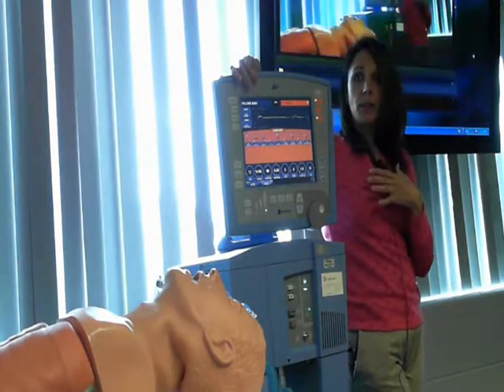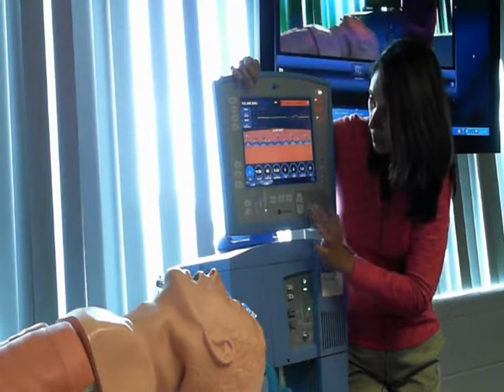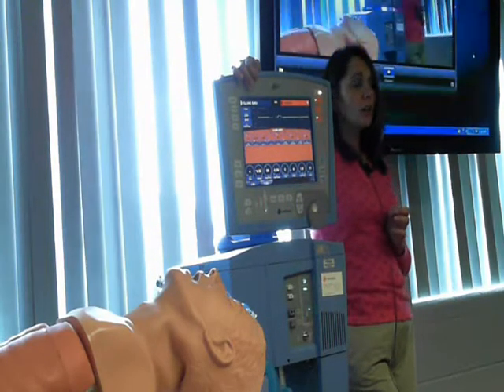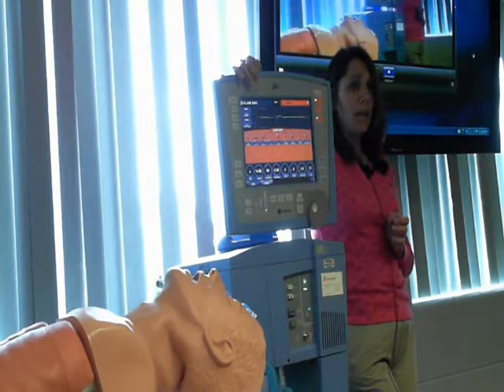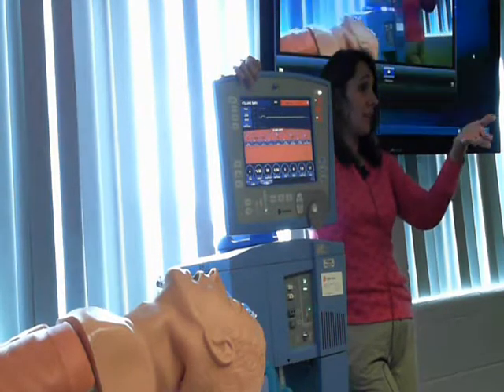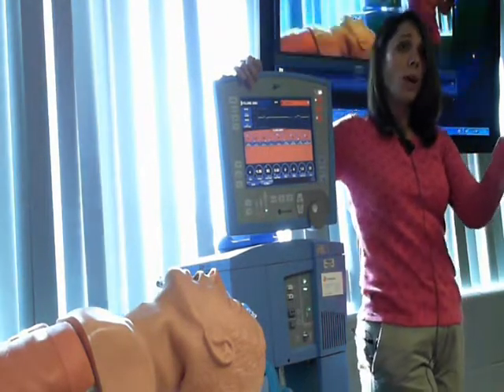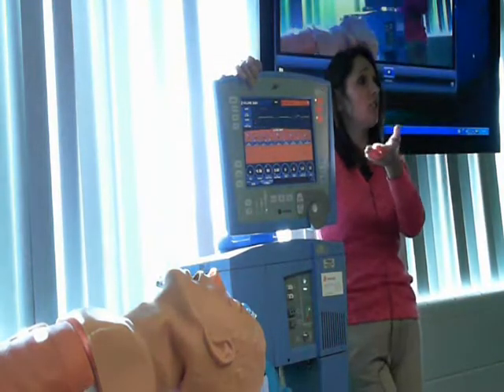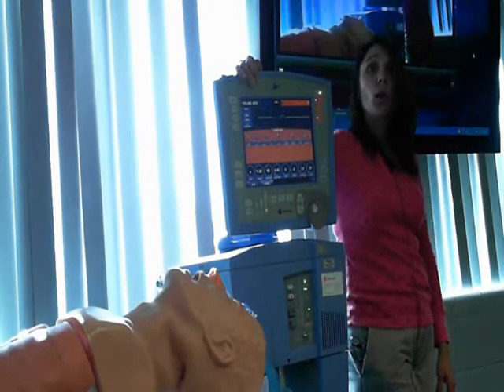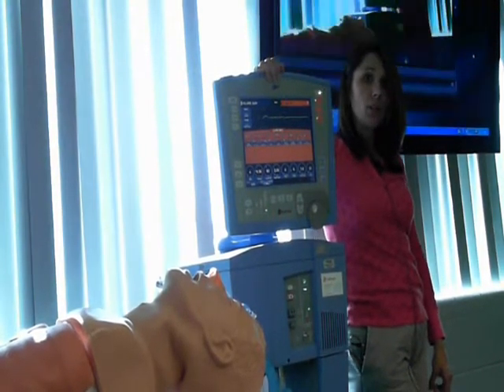If I, as the therapist, am weaning this patient and I've weaned them down to a respiratory rate of 4 on SIMV, and you're unaware, and that patient's saying, I'm in pain, and they rate their pain maybe a 9 out of 10, more than likely you're going to want to go ahead and give that narcotic. Now here's where it gets to be a slippery slope. What if you knock out the drive to breathe now? How many breaths is this patient guaranteed? 4. That's probably not going to be enough to be effective for meeting their metabolic demands in most people. Does that make sense to you all?